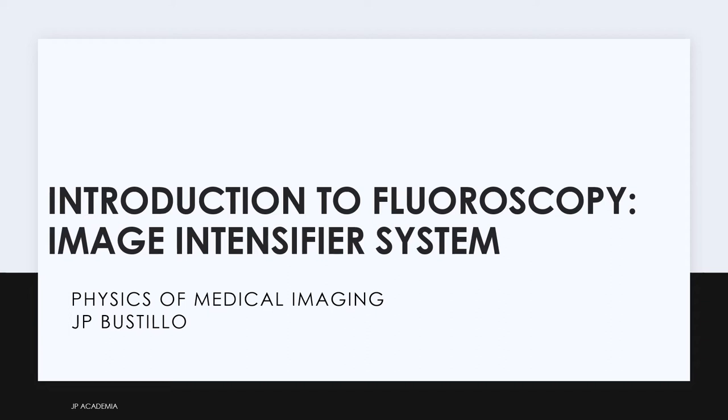Fluoroscopy, or real-time projection X-ray imaging, has been in clinical use since shortly after Roentgen's discovery of X-rays. Early fluoroscopes consisted simply of an X-ray source and a fluorescent screen between which the patient was placed. Currently, fluoroscopy systems fall into two distinct categories. First, image intensifier based, and second, flat panel detector based. In this lecture, we will focus on the image intensifier based fluoroscopy imaging system.